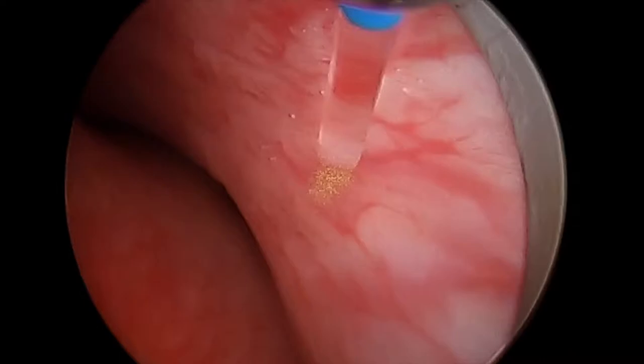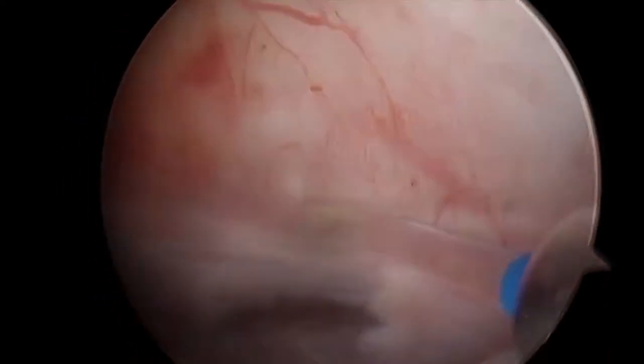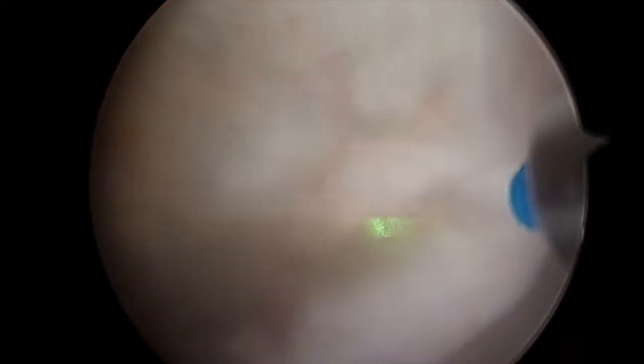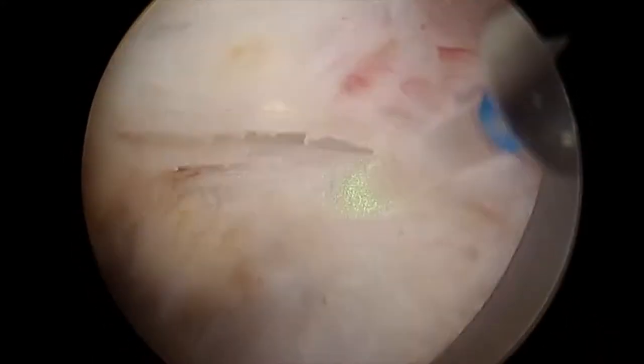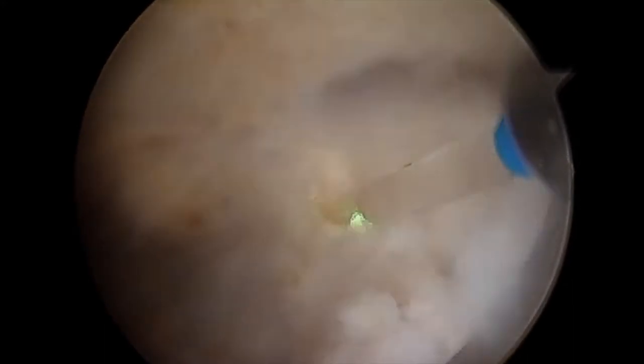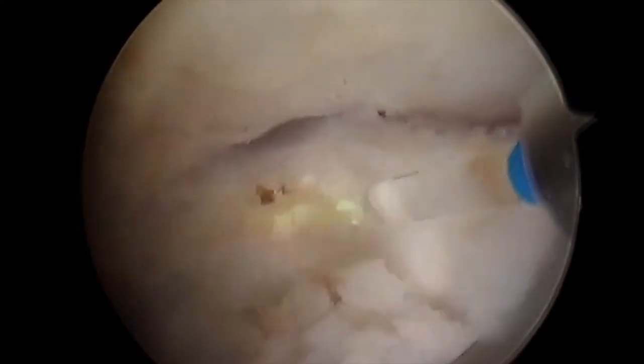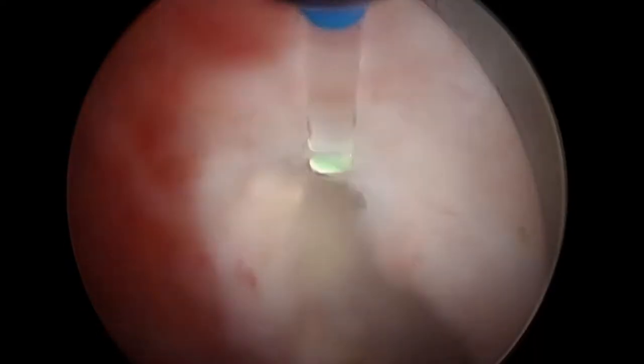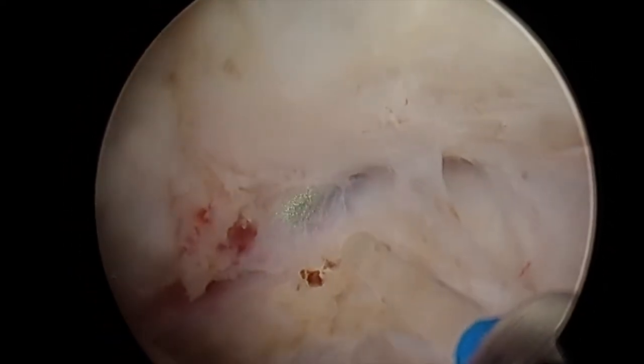What can be seen here is clearly the two lobes of the prostate. Resection is continuing along the left-hand side, and will be continued approximately up towards the bladder from six o'clock through to twelve o'clock.